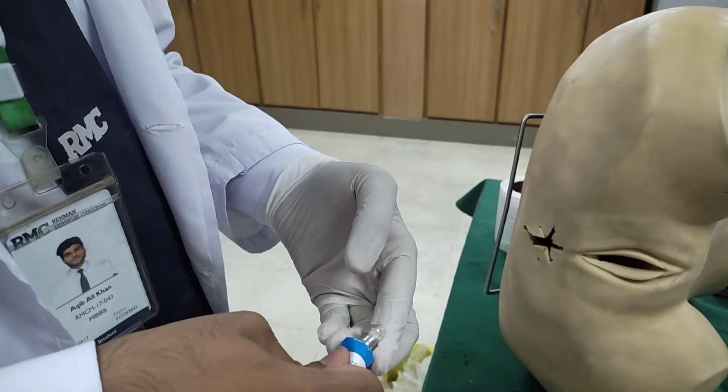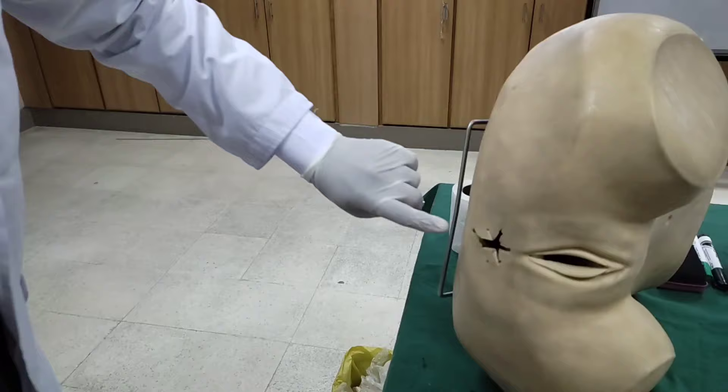This is lubricant, which is xylocaine — xylocaine, whatever you have. This is lubricant. We have to take this procedure with adequate lubrication.